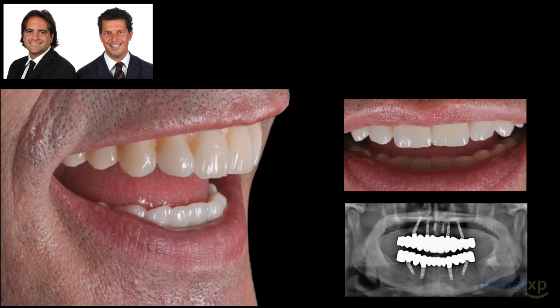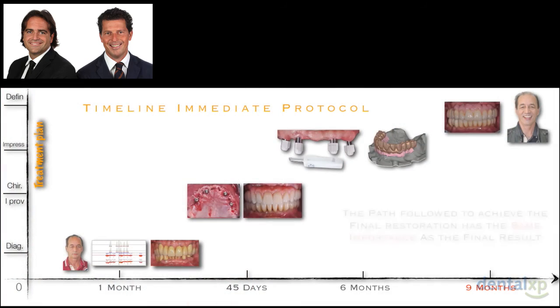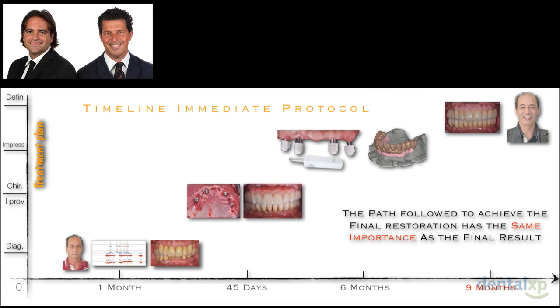Here are some pictures of the smile of the patient, because this is exactly what the other patients that are not dentists look at every day, how the patient is smiling. It's important always to have final x-rays where we can see that everything is working well also from the implant aspect. And you can see here the timeline of this immediate protocol that in 9 months permitted us to give Sergio a big increase to his quality of life.